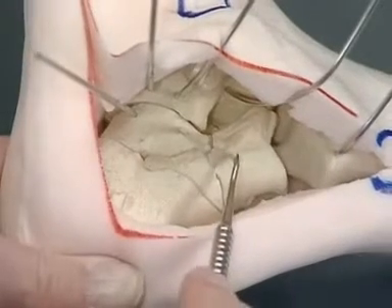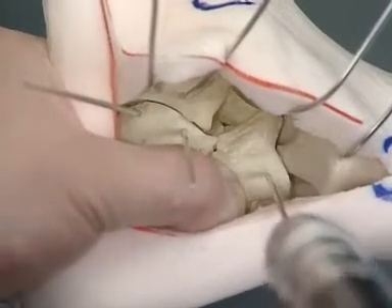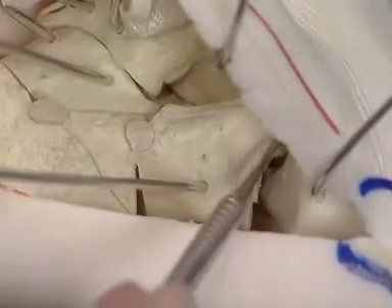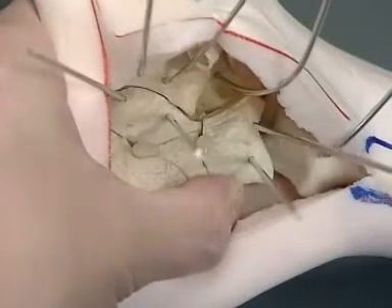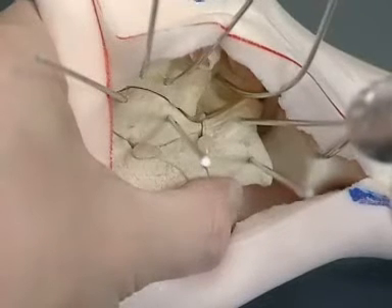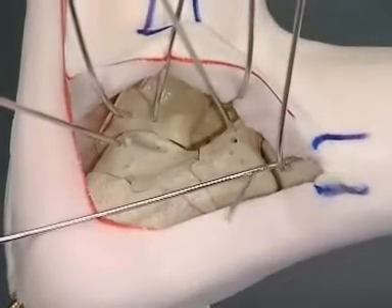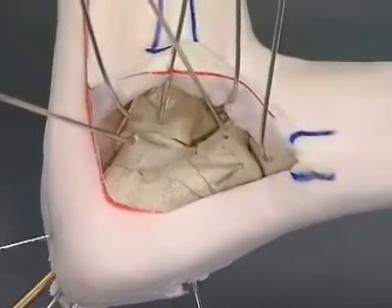The two fragments are fixed temporarily with two 2 mm K-wires. Before fixation with the second K-wire, the joint surface has to be checked for anatomic reduction. To hold the anterior process correctly in an anatomically reduced position, another K-wire has to be placed from posterior, fixing the tuberosity fragment with the anterior process fragment towards the cuboidal joint.